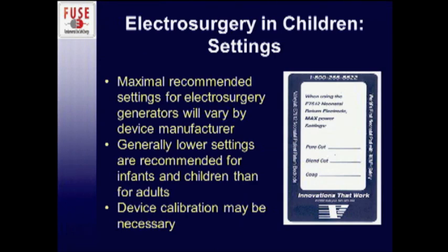Another comment that I will make is that one of the things I find since I have become a pediatric surgeon and operate mostly on children is those settings that may be astounding you, the low electrosurgery settings, your cut and your coag settings that people are using or talking about using here in these talks. I use less than that every single day, and I operate on 350-pound adolescents too. So we've learned in pediatric surgery, it's dangerous to use those high settings. We use the lower settings, and you can often do it safely.